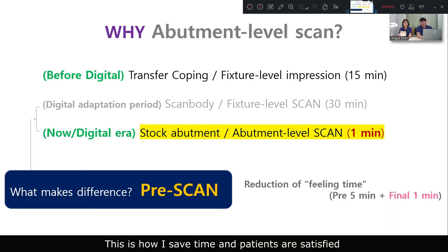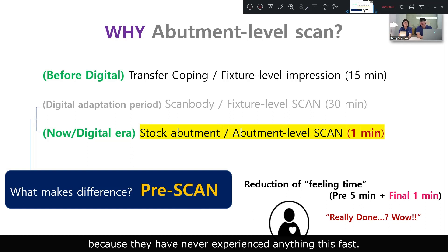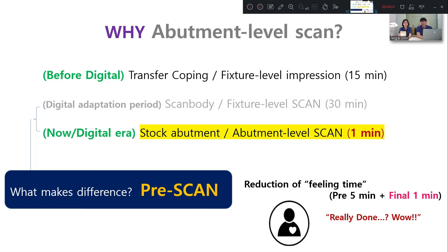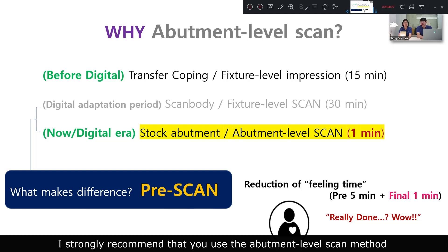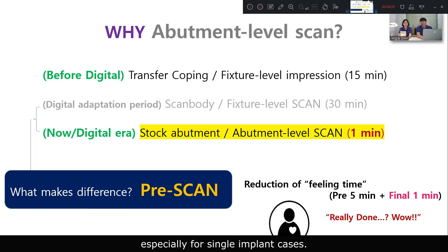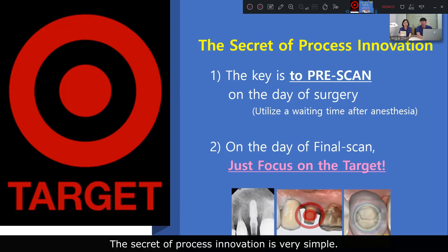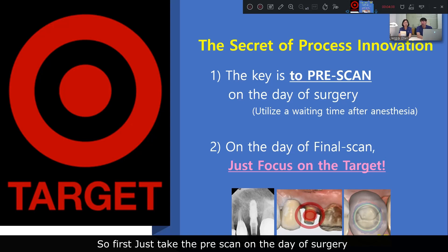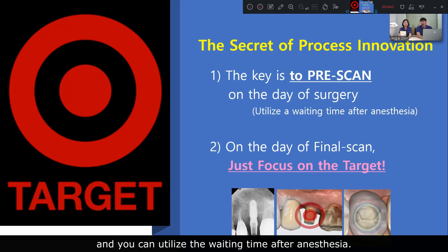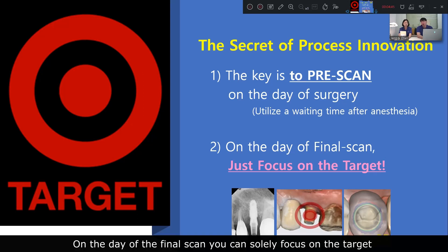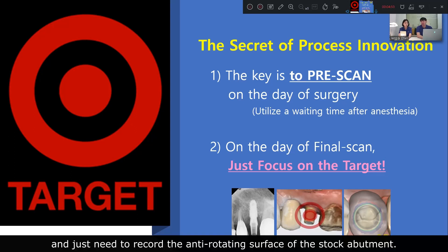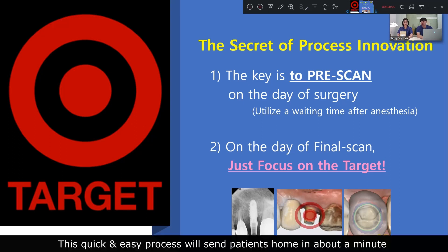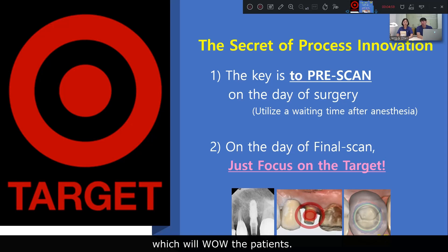This is how I save time, and patients are satisfied because they have never experienced anything this fast. I strongly recommend the abutment-level scan method, especially for single implant cases. The secret of process innovation is very simple: just take the pre-scan on the day of surgery and utilize the waiting time after implant placement. On the day of the final scan, you can solely focus on the target and just need to record the anti-rotation features of the stock abutment. This quick and easy process can scan patients in about a minute, which will wow the patient.